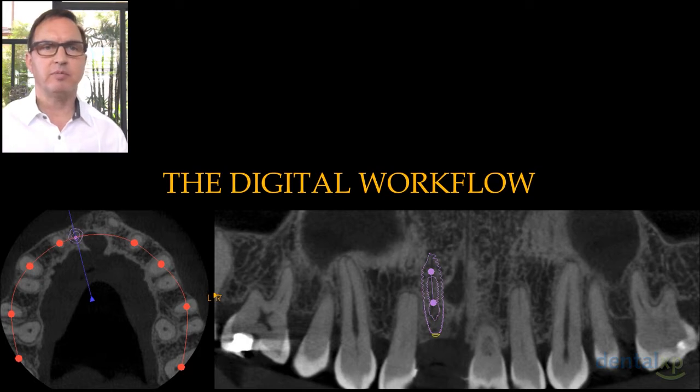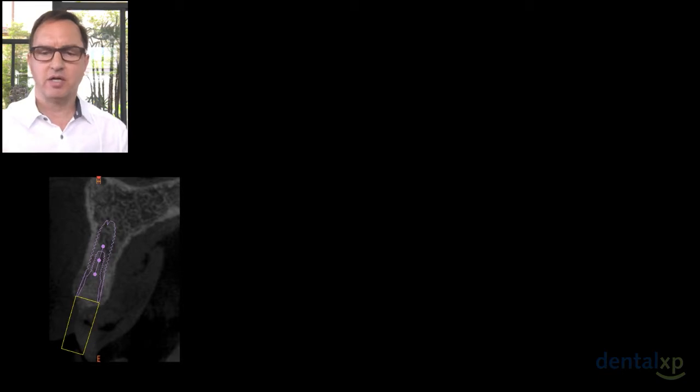Now the cone beam comes with native CBCT software, such as that which came with this Carestream 9300 image that you see in front of you. Some of those free softwares enable us to place implants, and they'll have a small implant library or even an elaborate implant library, and we can position implants and view those in several different cross-sectional views, and axial as well as coronal.